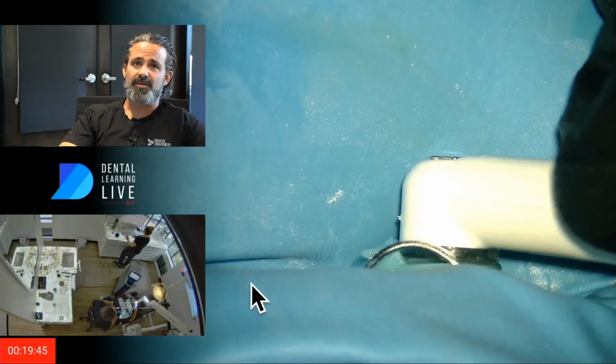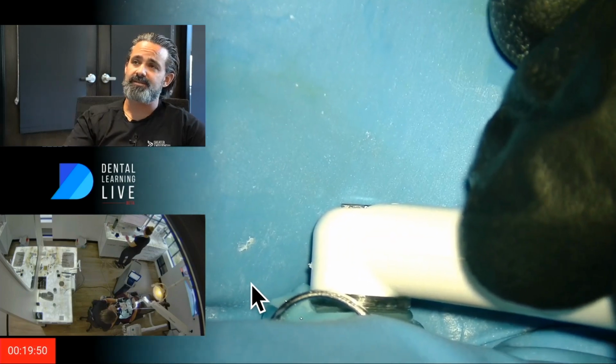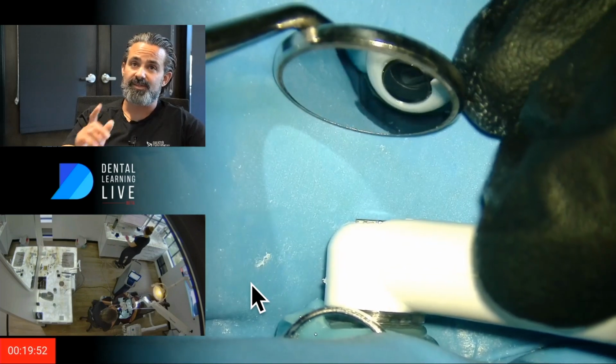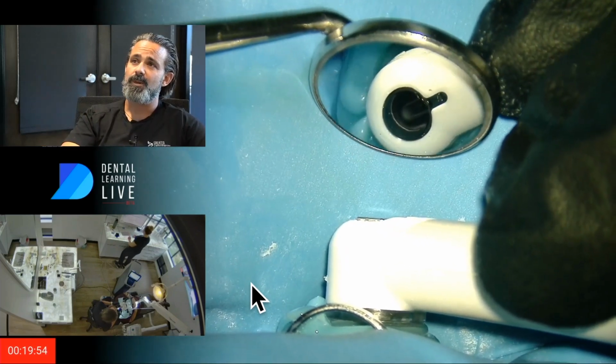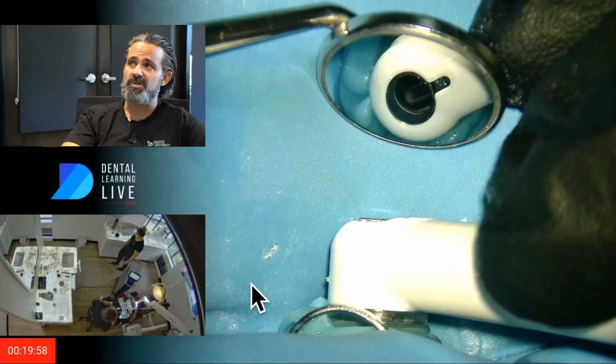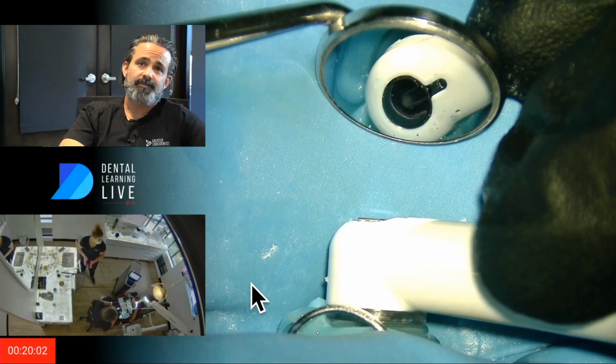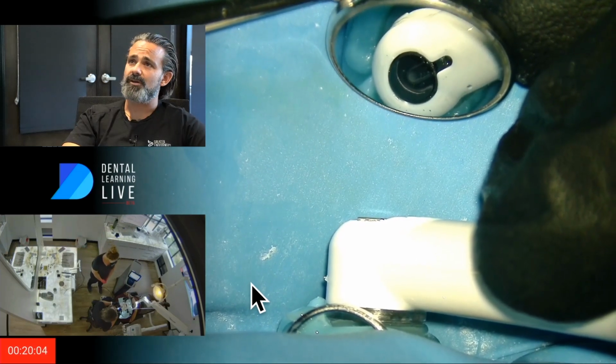But if I'm in the 46-minute range, I go by rules of 8s in my head, 8-minute cycles or steps in my head when I do the GentleWave. But a lot of times I'm getting these things under 40 minutes, so in the 30 range, which is good. I like it. It's a great workflow.